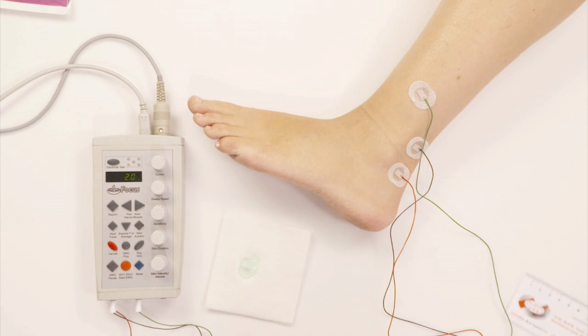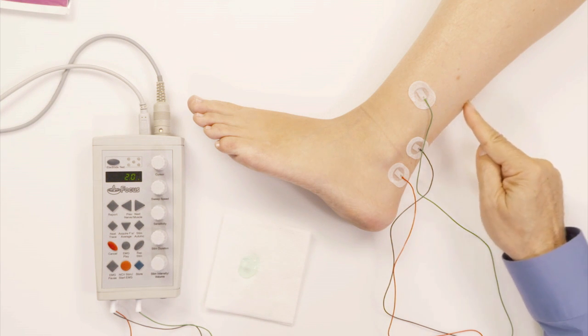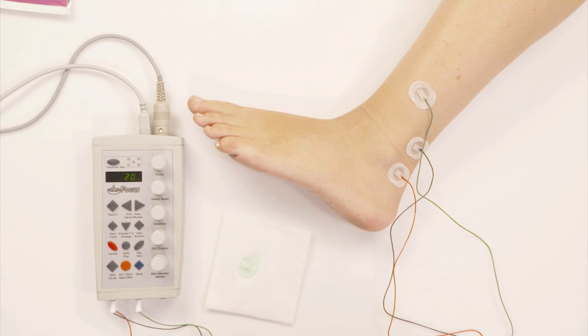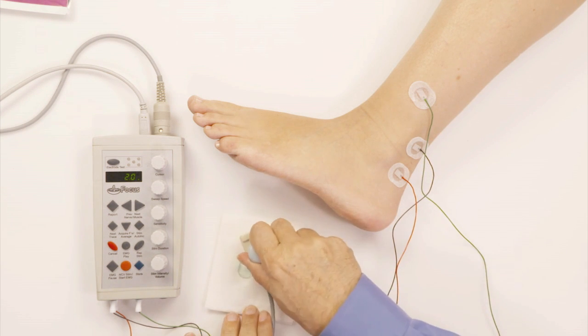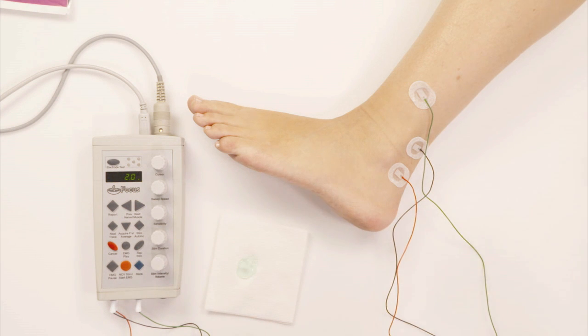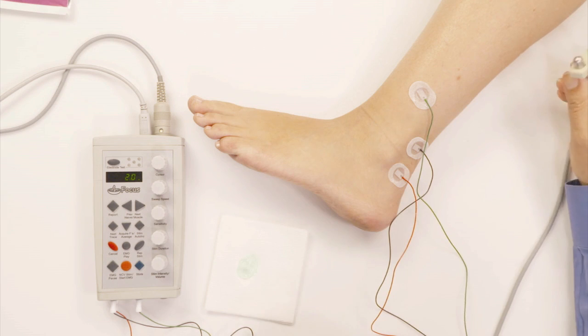It's much easier to record the sural nerve if you ask the patient whether they feel the electricity coming down their leg and around their ankle, because the sural nerve may not be exactly where you think you're stimulating it. If they feel the electricity coming from the back of the calf down to around the ankle, that means you're really on top of the sural nerve.